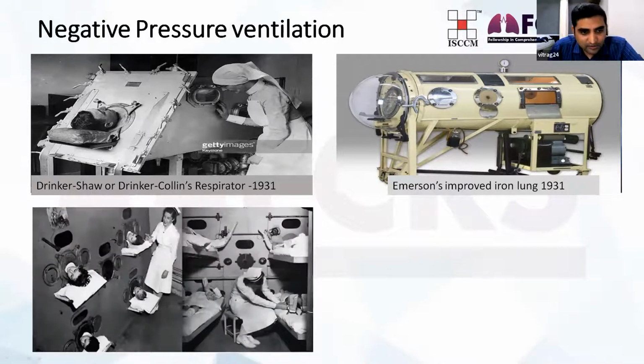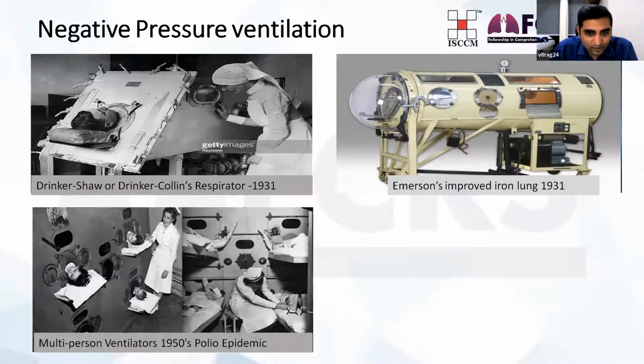Here we can see multiple patients in a single chamber. So to overcome the economic challenge, they developed this. And most inventions in the ventilation world occurred during the polio epidemic, like in COVID, where there were so many new innovations. So in the 20th century, polio led to rapid development and evolution of the concepts of ventilation.